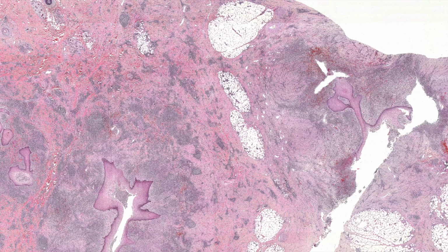You often have a lot of granulation tissue with edema. Sometimes you'll just see granulation tissue that has pseudocystic edema in the middle with no cyst lining at all. Sometimes it'll just be mostly scarred down with features of a burnt out ruptured cyst. Any of those combinations of features in the clinical setting of hidradenitis, I will say is consistent with hidradenitis.